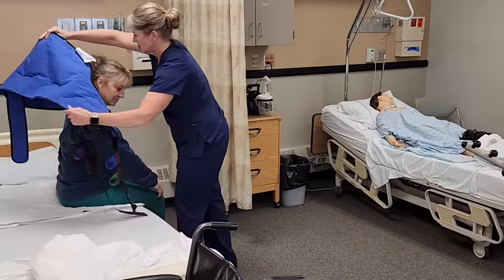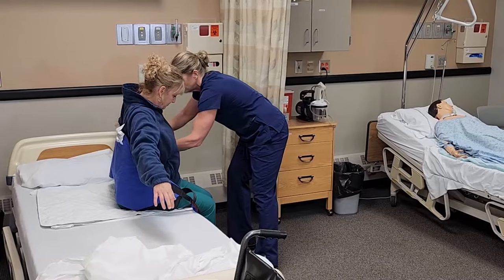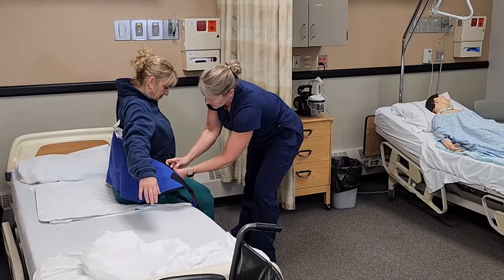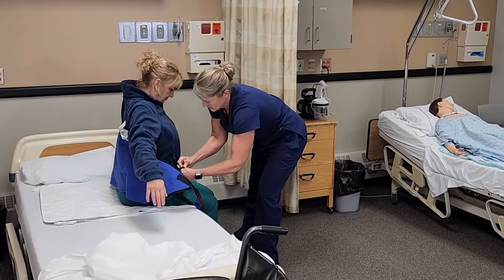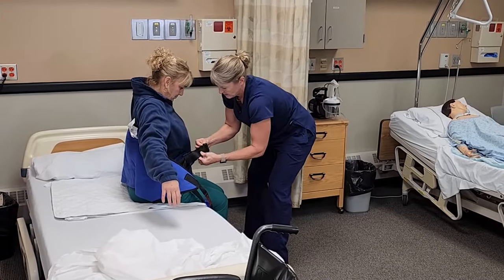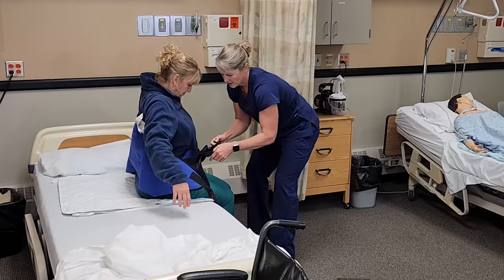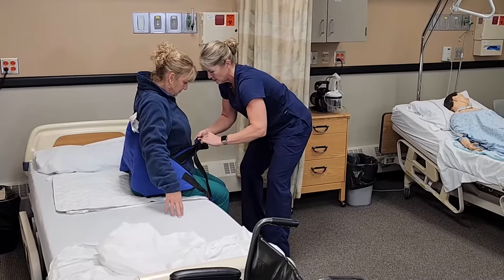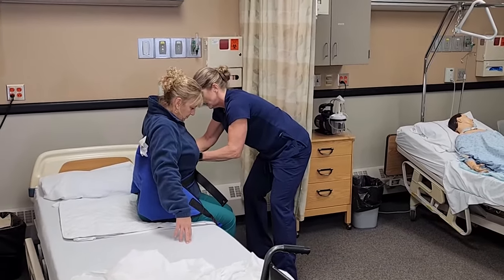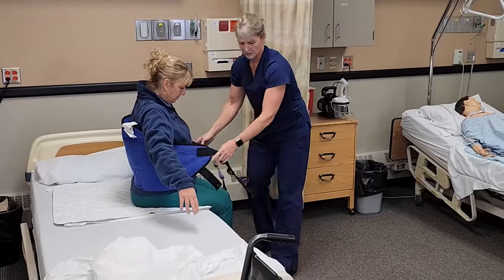I'm going to put that around her back and underneath her arms, and then we're going to get that seat belt buckled. We want it snug but not so tight that it's uncomfortable. Does that feel all right? We want to make sure those are underneath her arms to help lift her up.